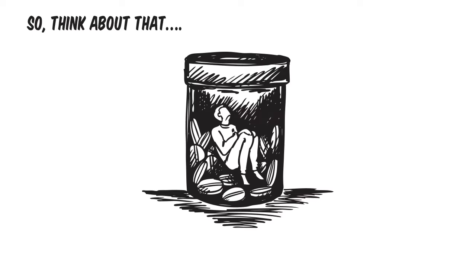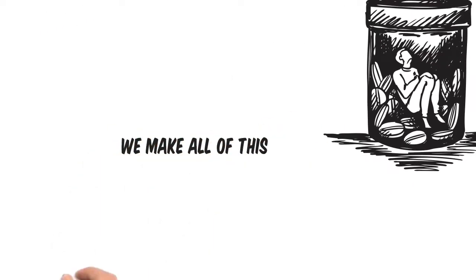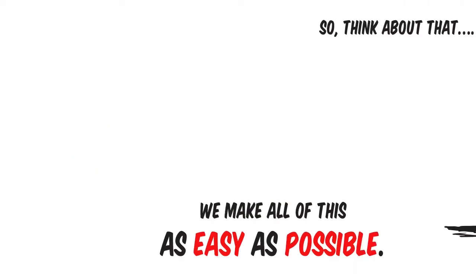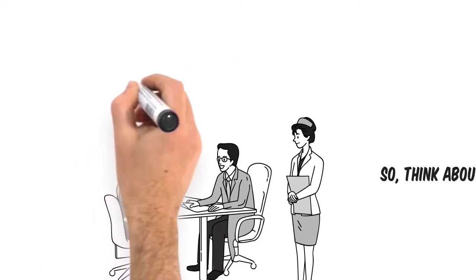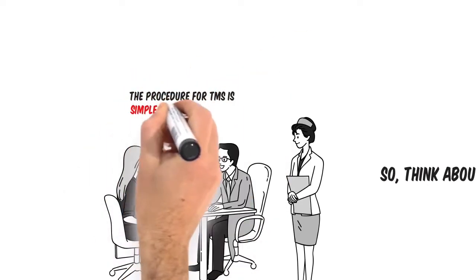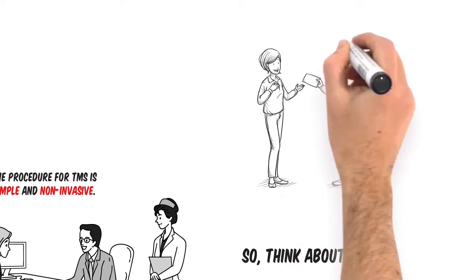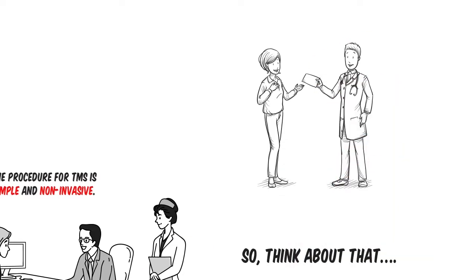We make all of this as easy as possible. After meeting with our doctor, the procedure for TMS is simple and non-invasive. This treatment session will last for approximately 20 minutes.